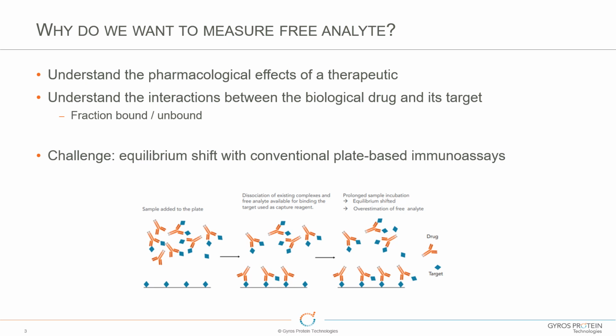Yeah, in the example shown here, where you look at the graphic below, you can see how the drug is at one equilibrium, and then you add it to this plate where there's a solid substrate of the target. You're going to see an equilibrium shift happen during that time. So the timing of that, and any dilution that takes place before that, is obviously going to disturb this situation.